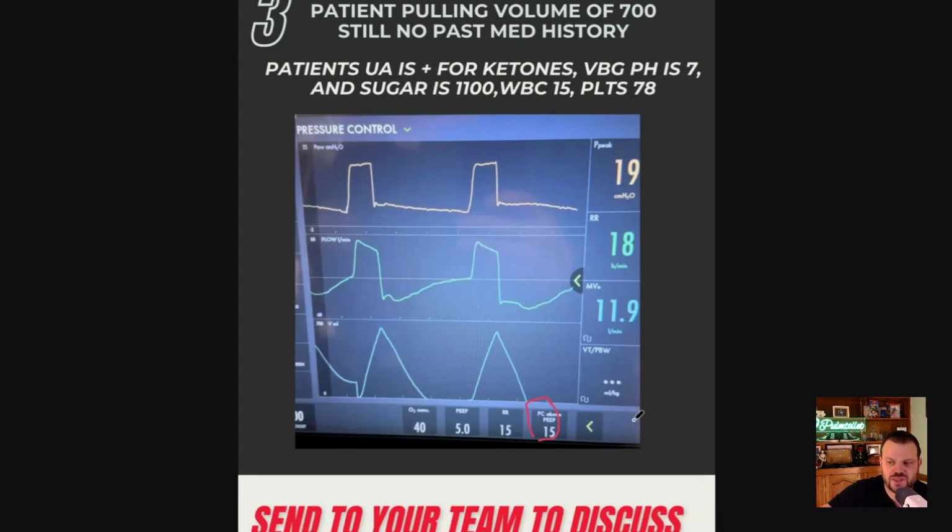The confusing thing is that people who call this driving pressure are presuming that the patient's passive, and the presumption is that the flow goes to zero. Because without those two criteria being met, you don't know what the plateau pressure is. So if the patient is not passive and they're pulling more flow and volume out of the circuit than their compliance would dictate based on a differential in pressure.